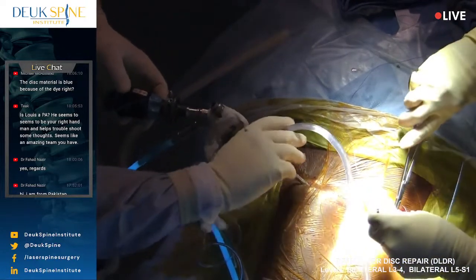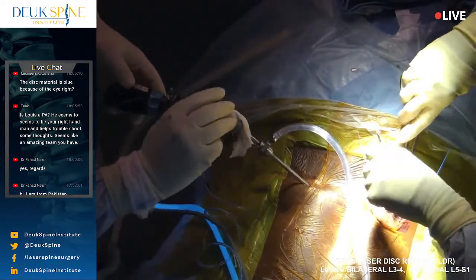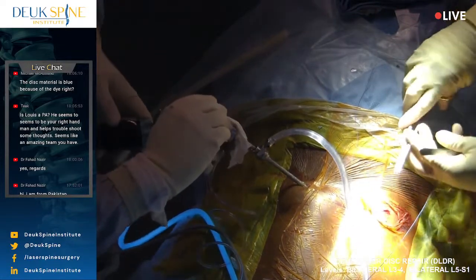Yeah, especially in a bilateral case, it's good to have, you know? So he can wipe while you close.